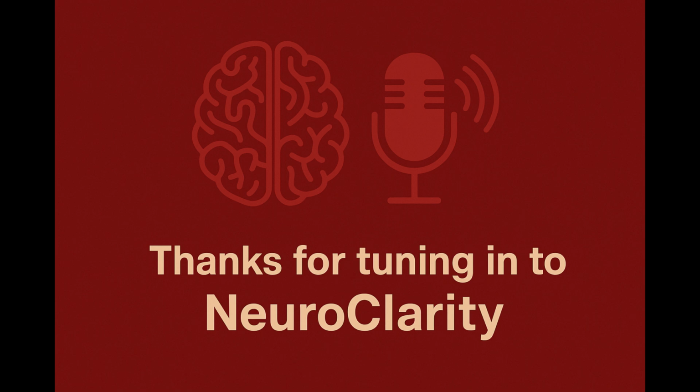And that's a wrap for today's episode of NeuroClarity. We covered how to read T1, T2, and STIR spinal MRI, and we saw the clinical clues and radiological signs of spinal DAVF. We learned why early recognition can be the difference between walking and permanent disability. And until next time, stay curious, stay clear, and keep learning.